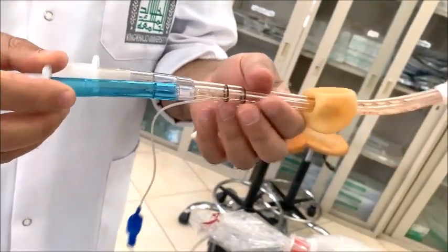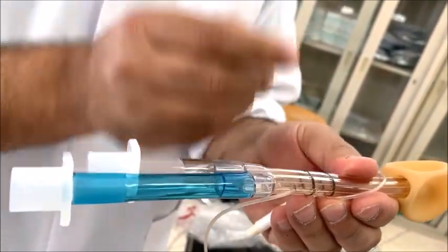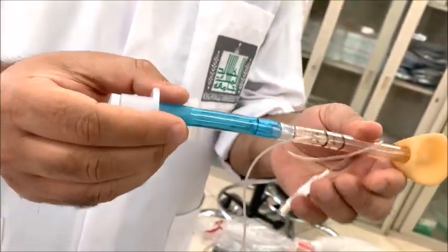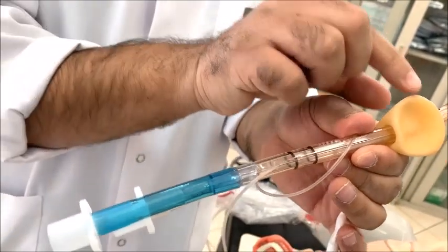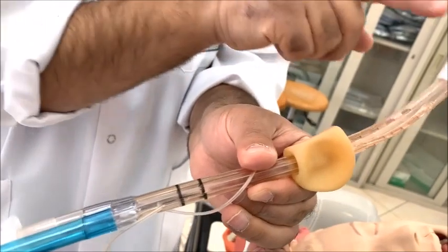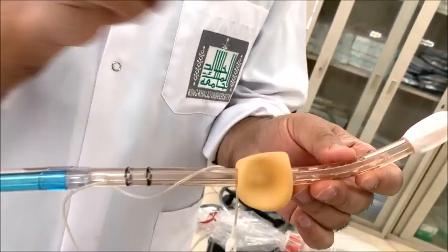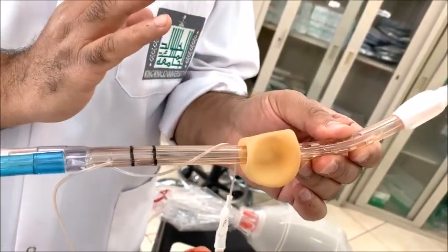There are two black markings, known as the depth markers. You have to keep these depth markers at the incisor levels. There is also a color coding — one is blue and the other is white. The blue lumen ends just below the proximal cuff, and the white extends up to just distal to the distal cuff. In 95% of cases, the distal cuff or distal lumen is in the esophagus when we insert it.